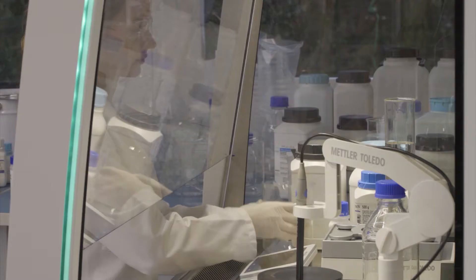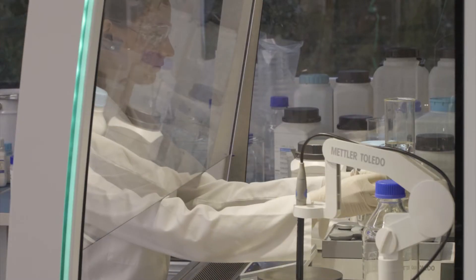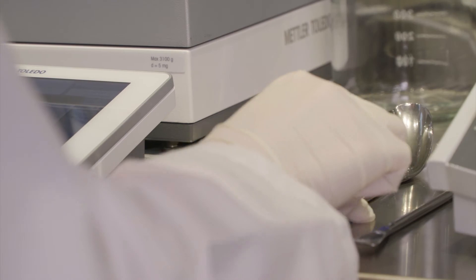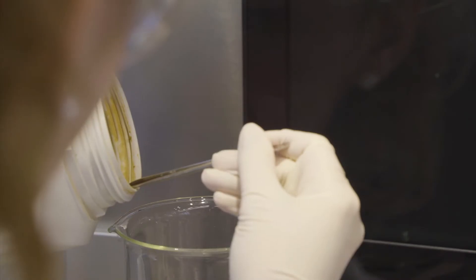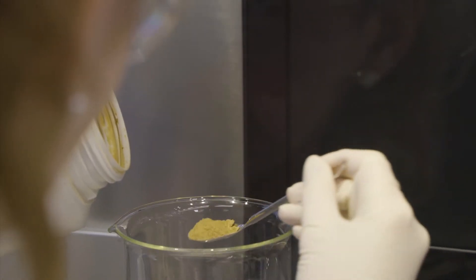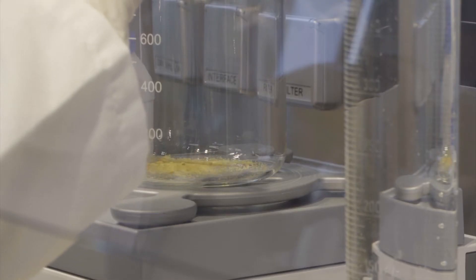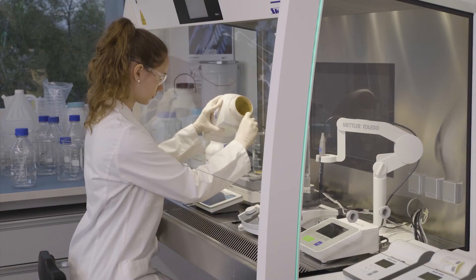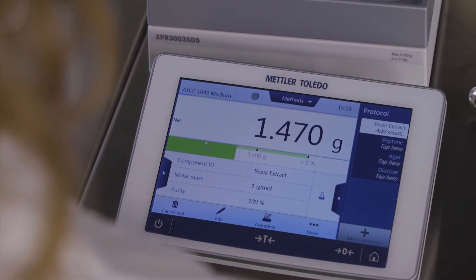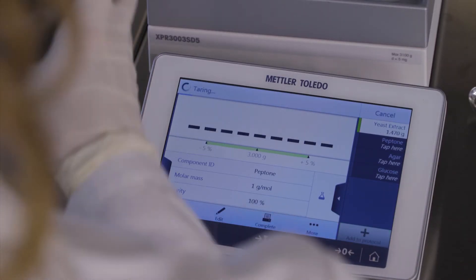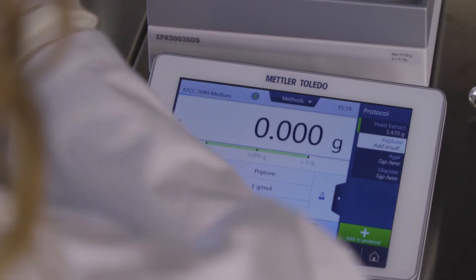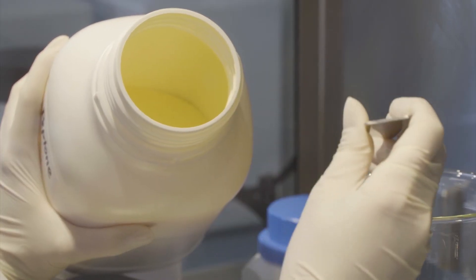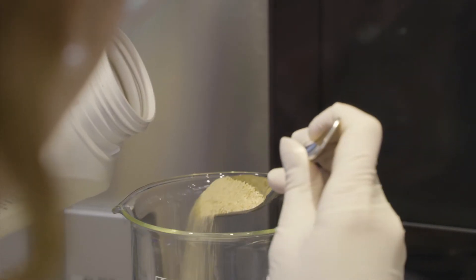Step-by-step instructions guide you through the whole process. The SmartTrack weighing guide makes it easy to weigh in each ingredient within the predefined tolerances, and all the required ingredients can be conveniently added to one container.